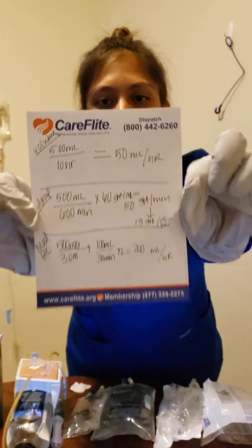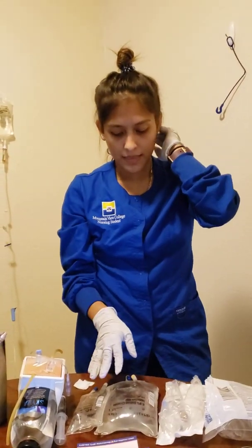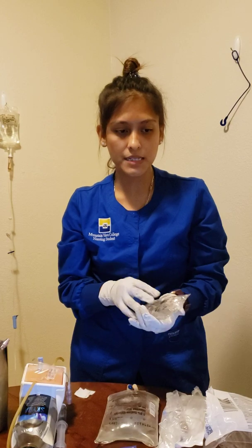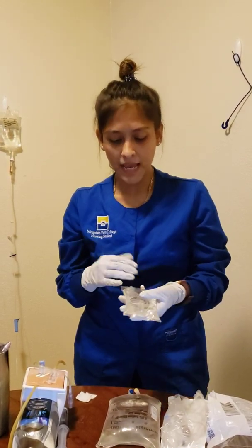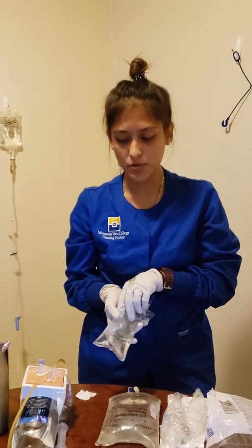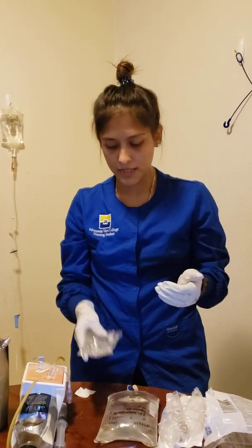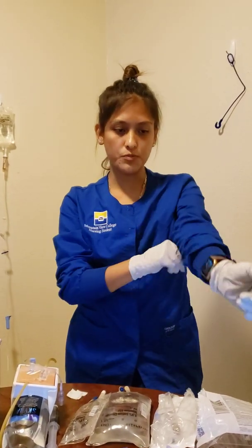And so I've gotten my meds here and I want to make sure that they are compatible, and they are. I've also checked drug side effects for the ampicillin, and it causes nausea, vomiting, and diarrhea. And it's within range, and I'm able to give it to my patient. So I've gathered all my supplies, like I said. Everything is great, nothing is expired, and I'm ready to go into Miss Chi's room.